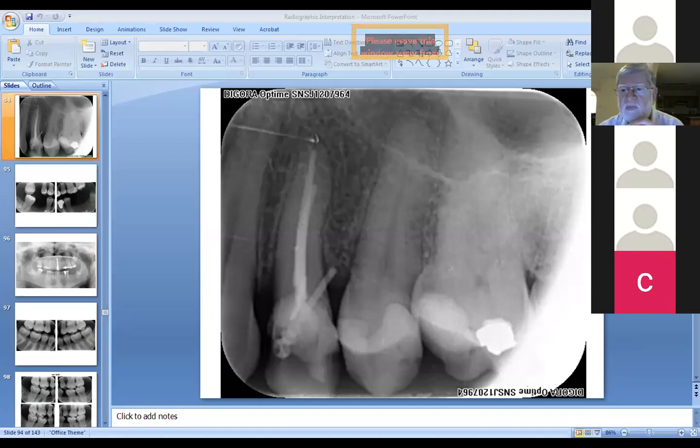Thank you. Another question, sorry, I'm going a bit back and forth, but with regards to assessing risk of oroantral communication, you mentioned on a previous OPG that the risk was low, even though the roots appeared to be adjacent to the sinus. How can you tell? Tougher one.